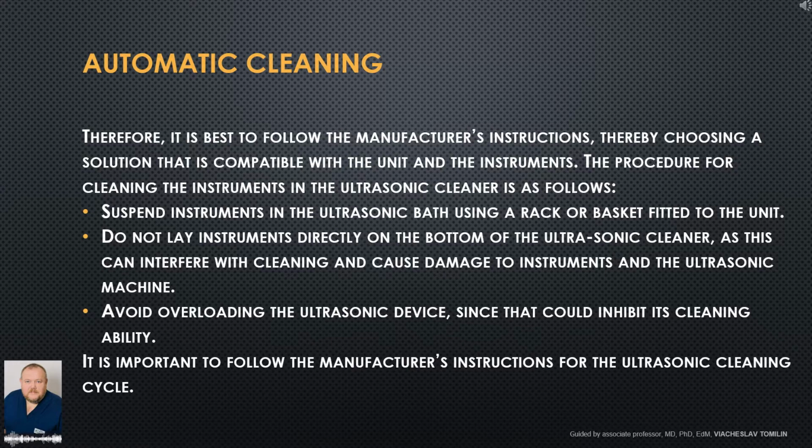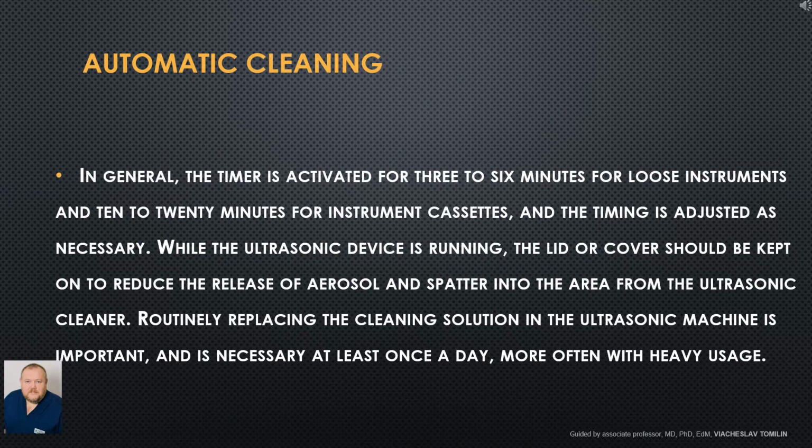Suspend instruments in the ultrasonic bath using a rack or basket fitted to the unit. Do not lay instruments directly on the bottom of the ultrasonic cleaner, as this can interfere with cleaning and cause damage to instruments and the ultrasonic machine. Avoid overloading the ultrasonic device, since that could inhibit its cleaning ability. It is important to follow the manufacturer's instructions for the ultrasonic cleaning cycle. In general, the timer is activated for 3 to 6 minutes for loose instruments and 10 to 20 minutes for instrument cassettes, and the timing is adjusted as necessary.